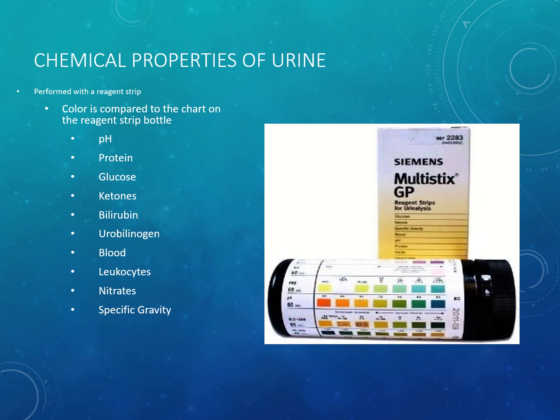So this is the typical urine strip container. This is what it's going to look like, and it has this chart on the outside that has different colors that you're going to compare your strip to. These strips are very sensitive to air and light, so you always want to keep them inside the container with the cap tightly closed, and take it out when you're going to use it and make sure you close it again and keep it at room temperature.